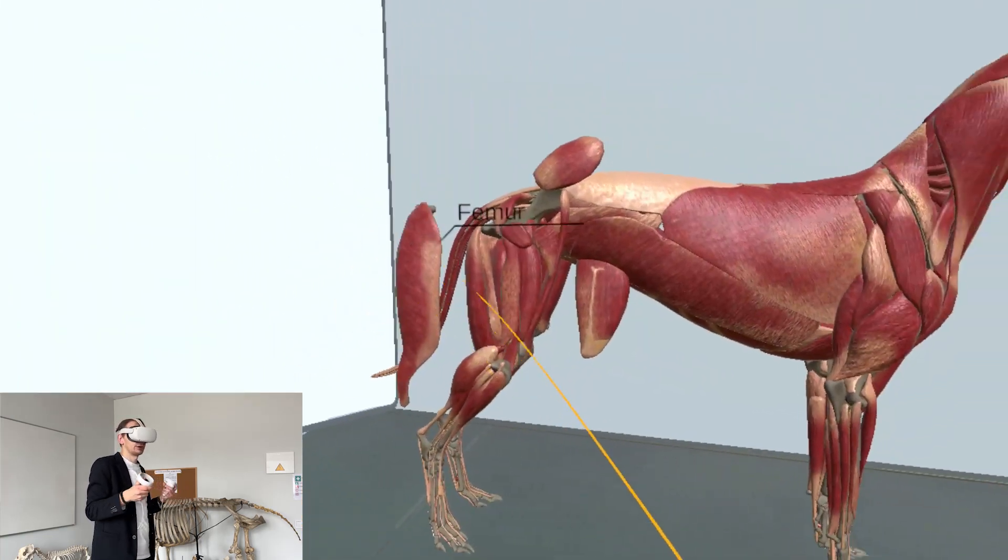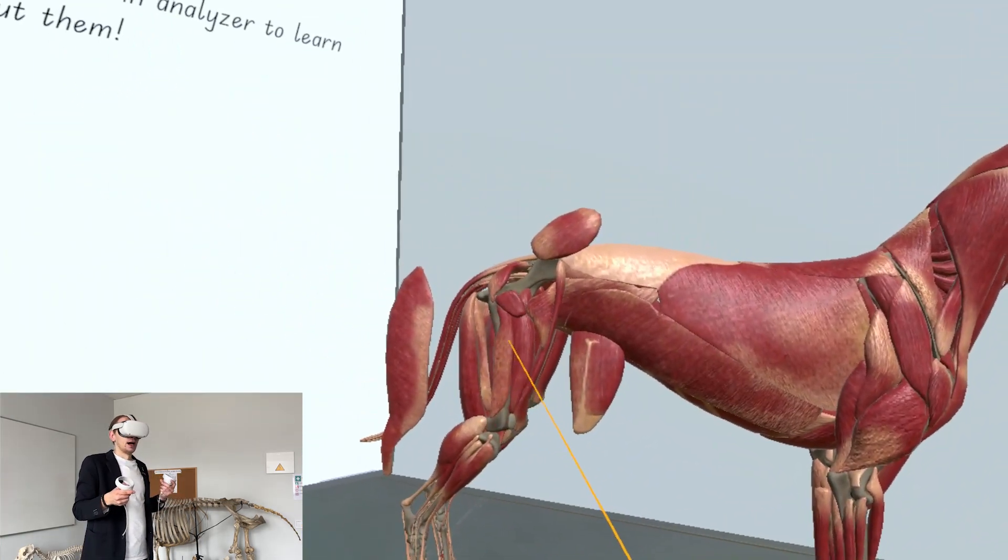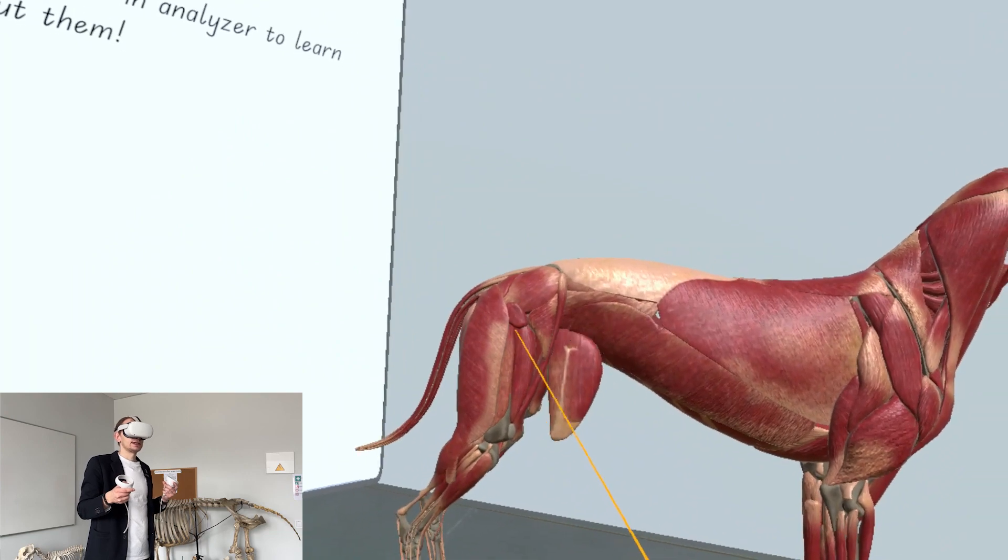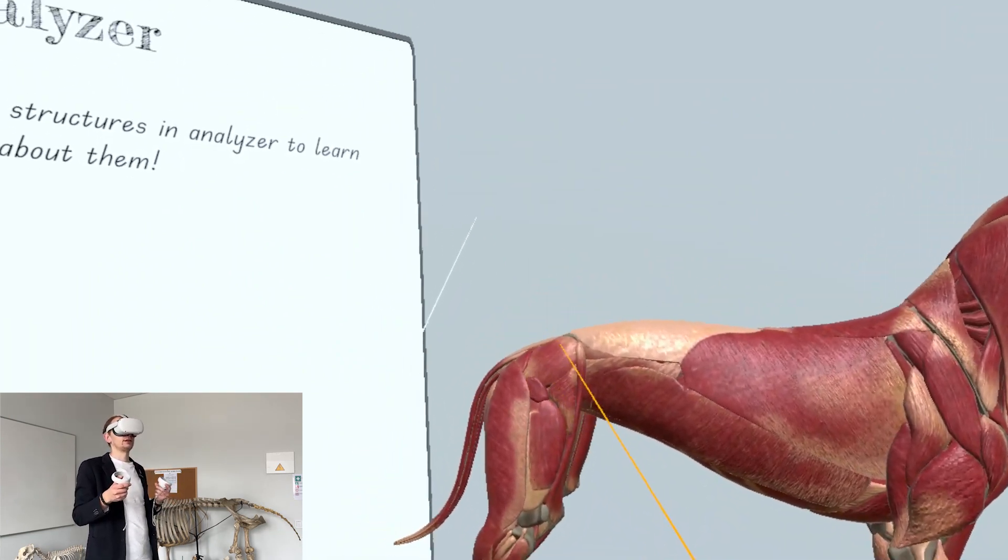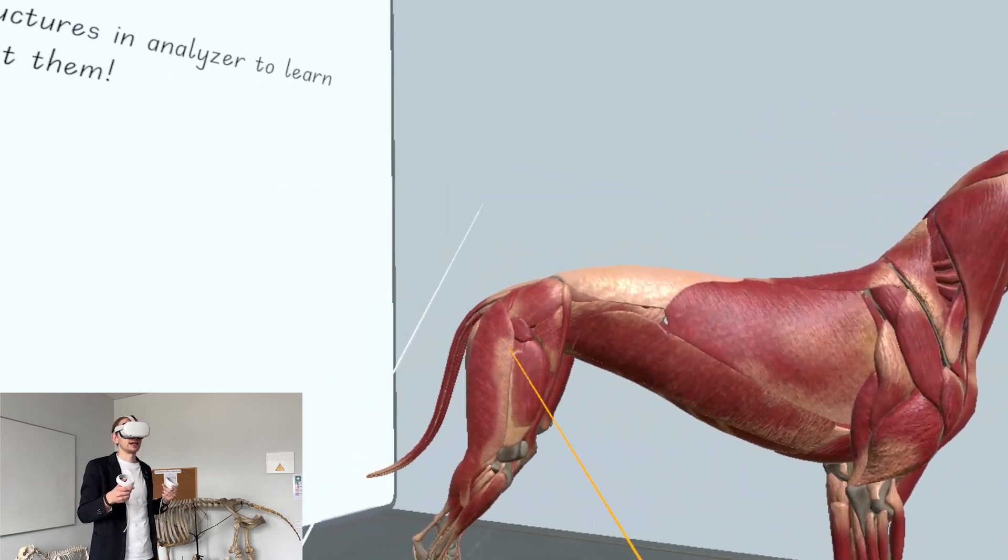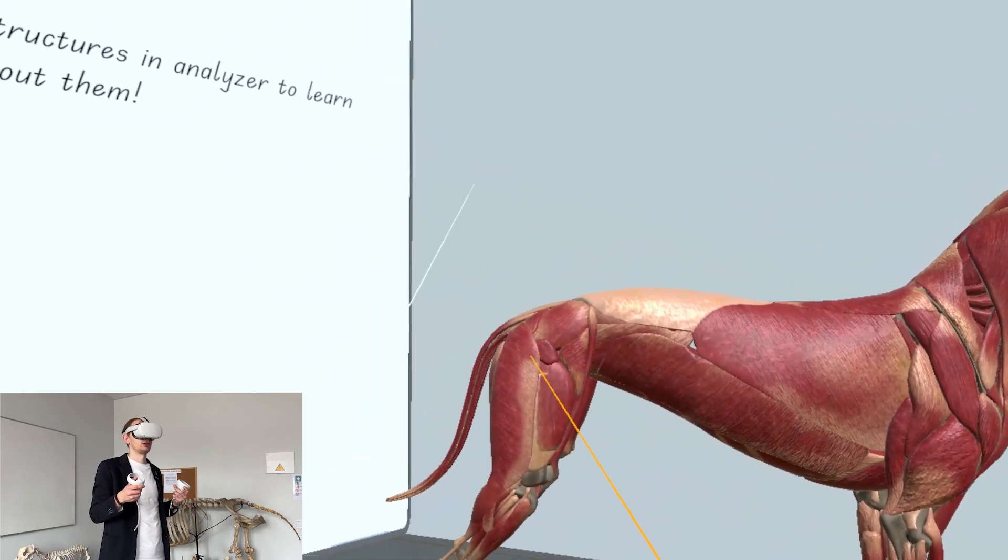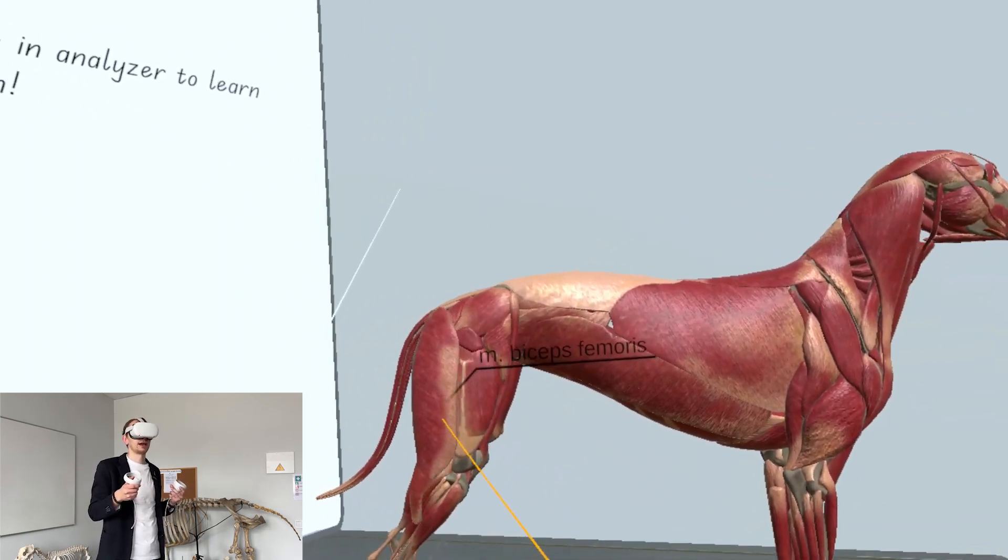We can return our femur to place. In this case, we're making the cranial lateral incision, going through the skin, and to get greater visualization we need to interact with the biceps femoris muscle.